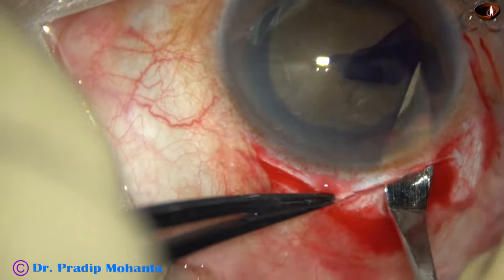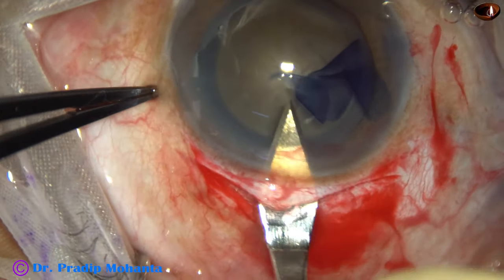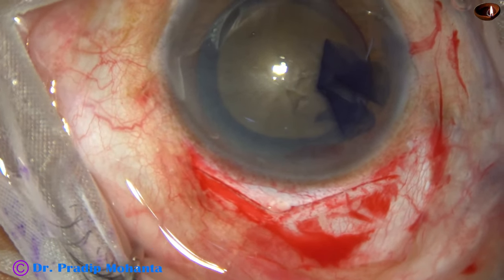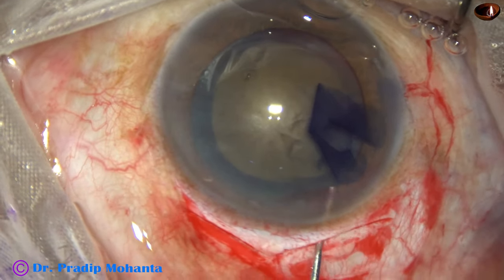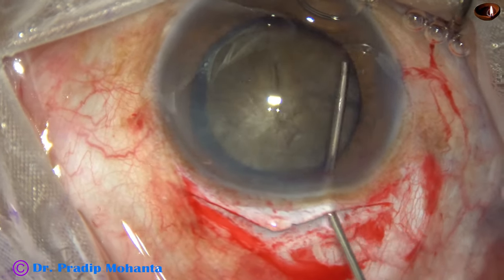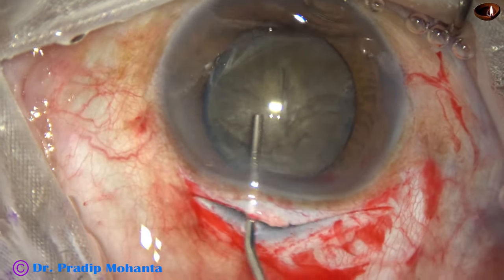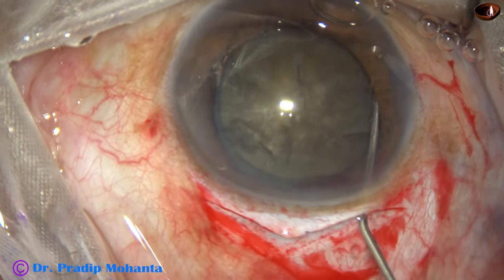Now, the sclerocorneal tunnel is opened inside. We cut the tissue only when we go forward. Hydrodissection is done. For a hard cataract, we inject small amounts of fluid at multiple points.